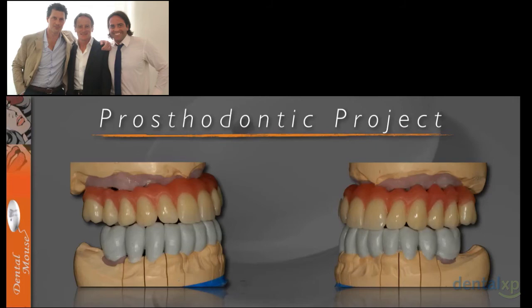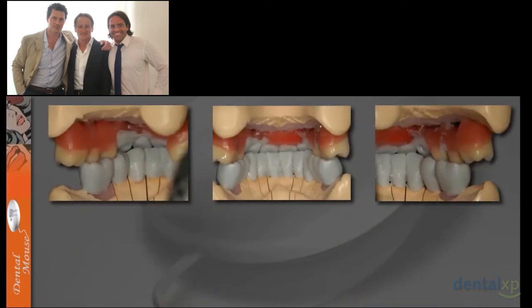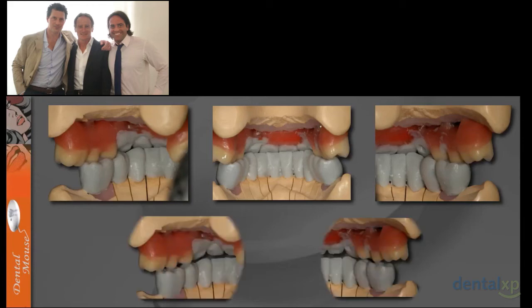He's going to correct all the occlusal things that he thinks need to be corrected, and from there he can put his background and knowledge to our service. You can see, from an inside perspective of this prosthodontic project, all the occlusion and all the function that has to be studied.